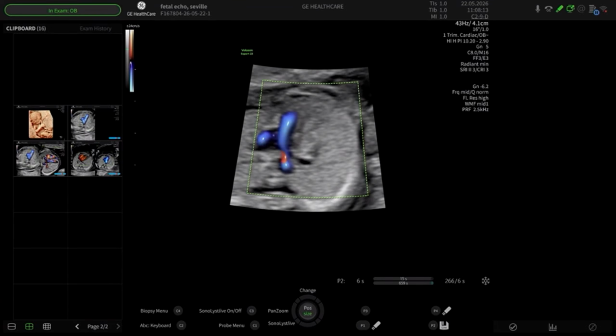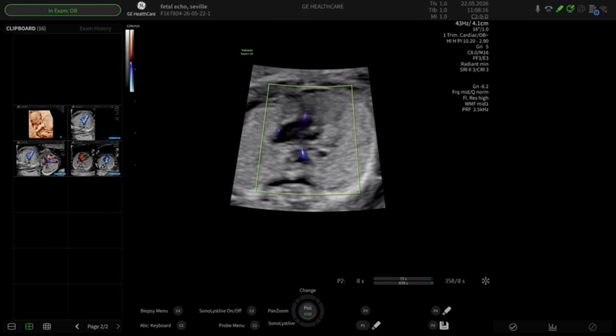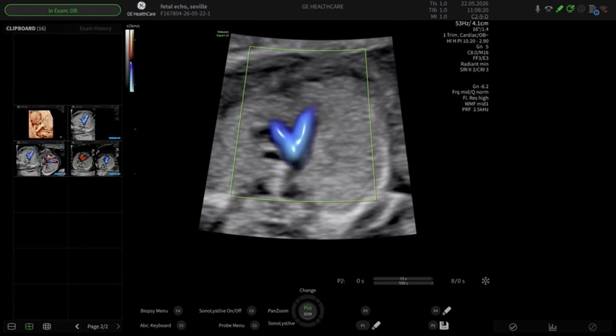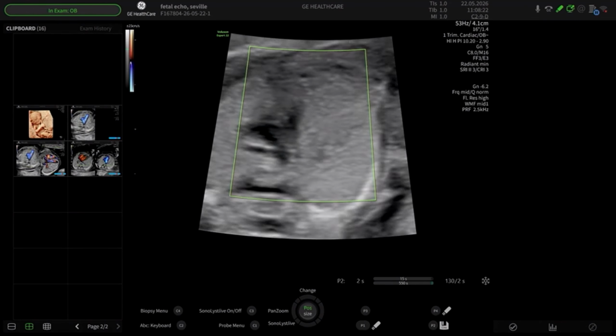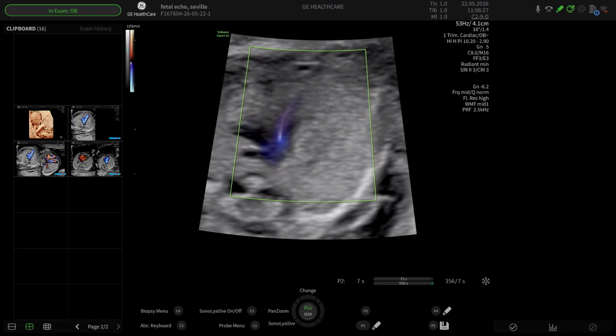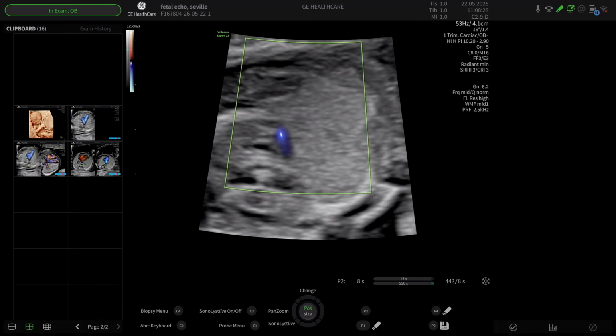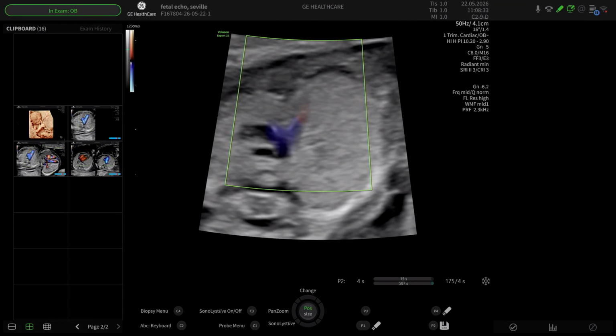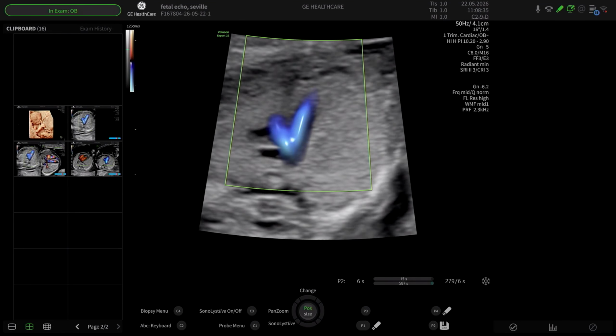And as I do so, I then look for the main pulmonary artery coming out of the right ventricle. This is a first trimester scan, and seeing the pulmonary valve is not as important as it is at the third trimester because it tends to be an evolving cardiac lesion during pregnancy. It's uncommon to make a diagnosis of isolated pulmonary stenosis in the first trimester. We do make it with tetralogy of Fallot, and I will talk about that later this morning.